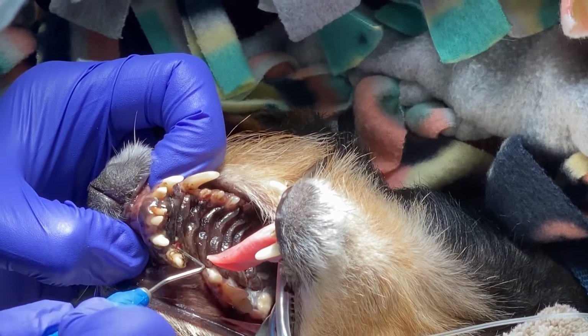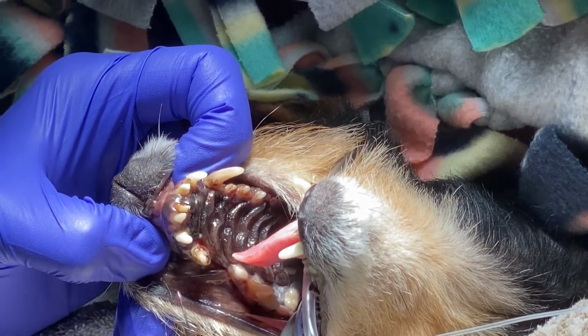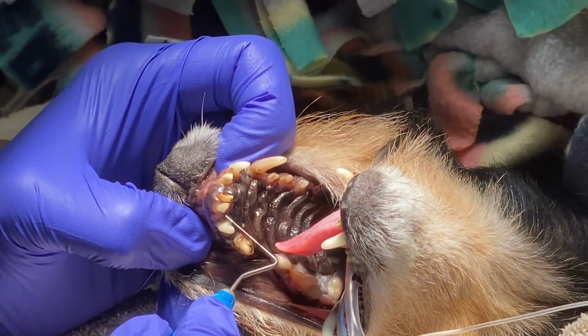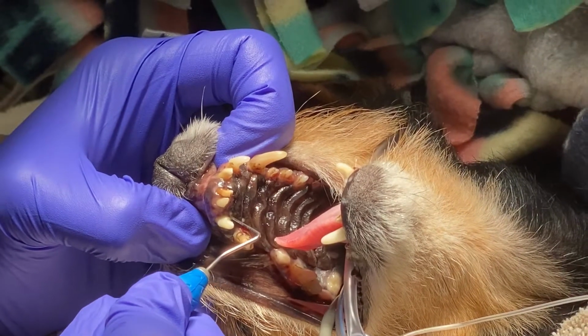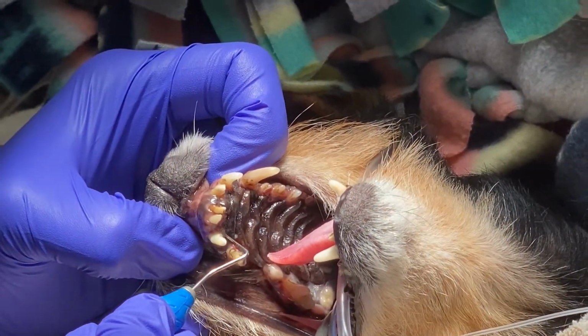And a pocket just means what you can go into? Bingo. Can you also see too, I've got pus coming out of this? Yes. This tooth? All right. This tooth is also mobile, also has pus coming out and around it. And this one, you can see I was able to go into approximately a 6 millimeter pocket on that tooth.